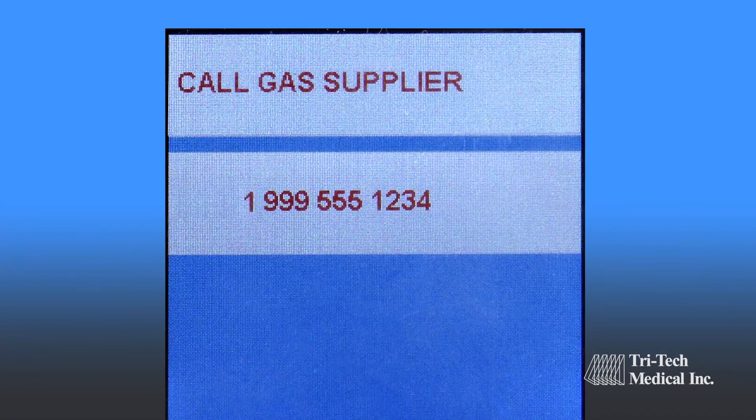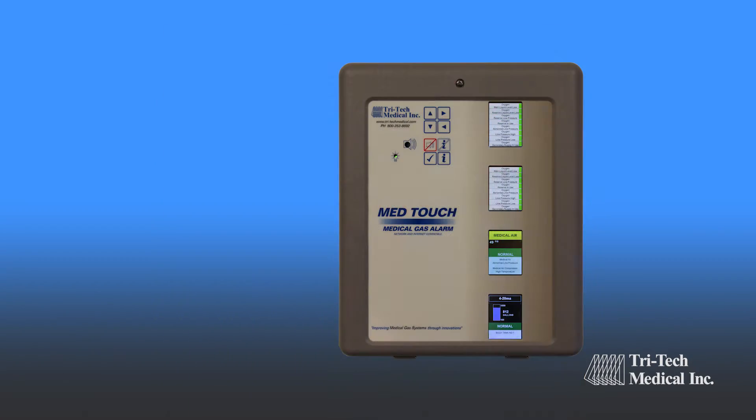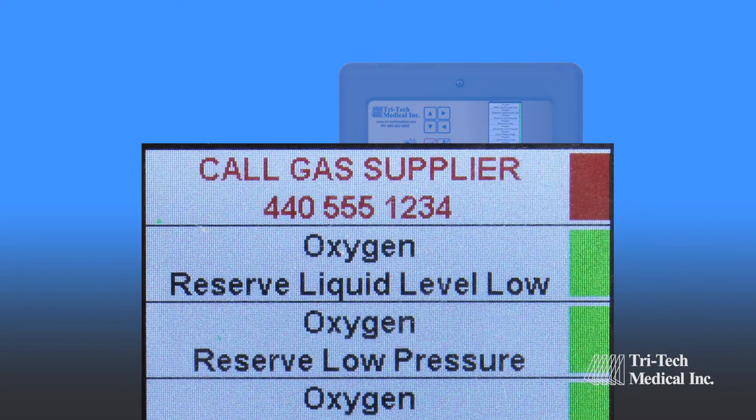MedTouch Alarm panels allow users to input customized emergency preparedness instructions for each alarm signal, which will be displayed when the signal is in alarm condition, alternating with the area of surveillance.